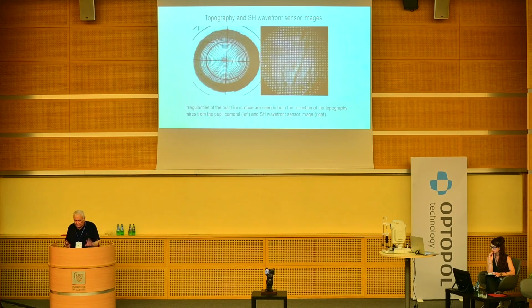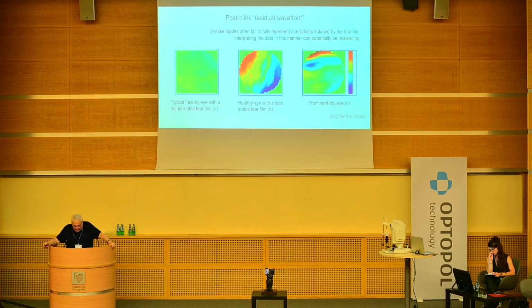And you see some changes in the Placido, and very good, the Shack-Hartmann picture. It looks very natural, like you see the distortions. This is another approach.